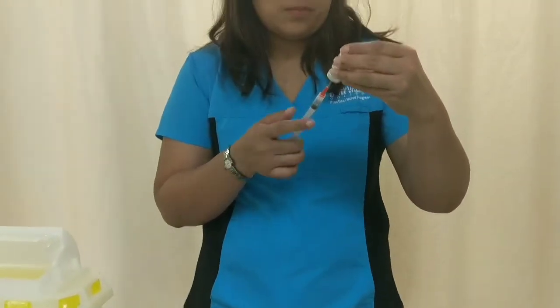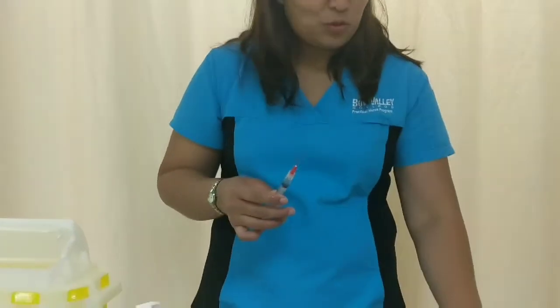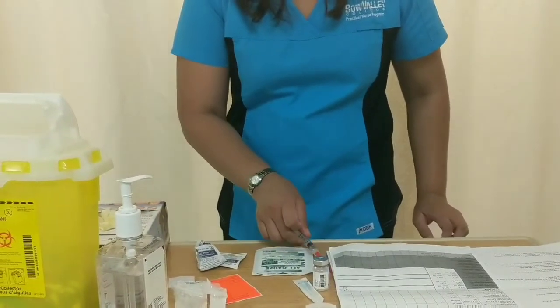Aspirate the desired dose and make sure that there is no bubble in the syringe to avoid medication error in terms of the dose of the medication.